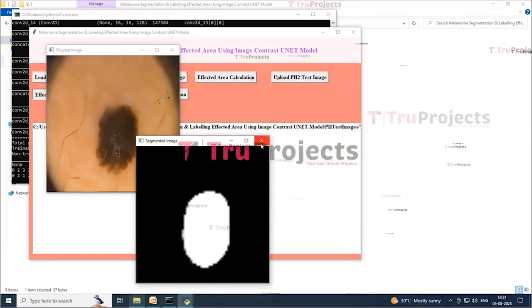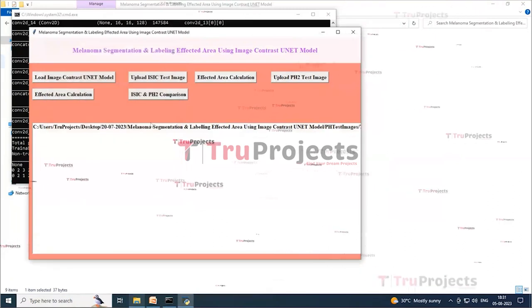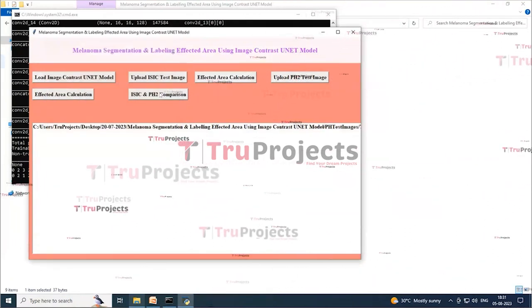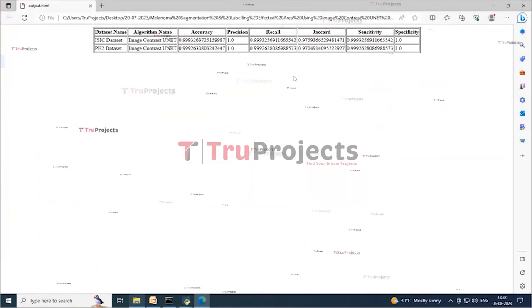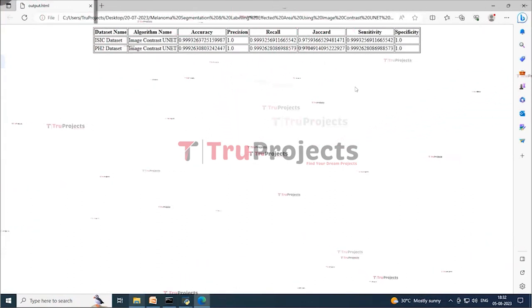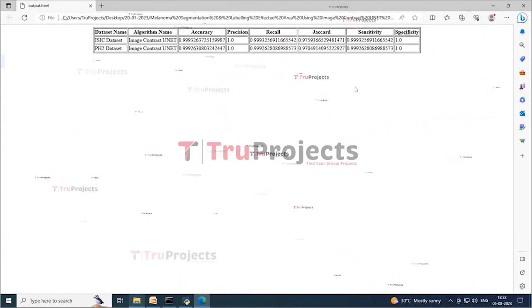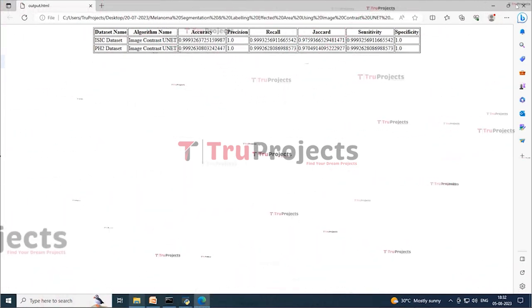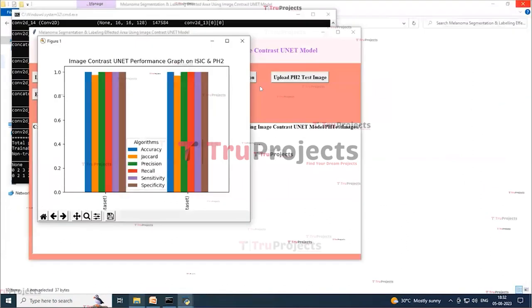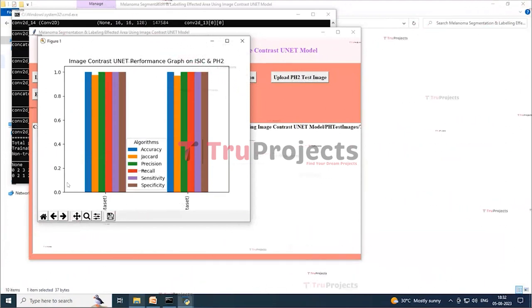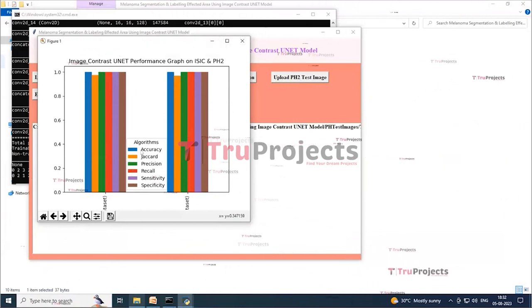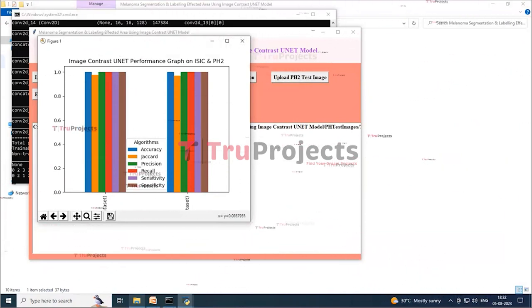Click the ISIC and PH2 Comparison button to get the output. The screen shows the performance of the Image Contrast UNet model on both datasets. You can similarly upload and test with other images. A performance graph is also displayed showing the Image Contrast UNet performance on both ISIC and PH2 datasets, with different colored lines representing the algorithm results.